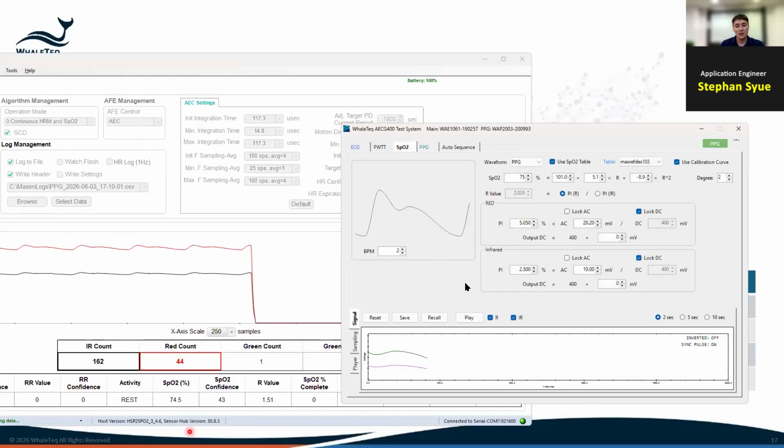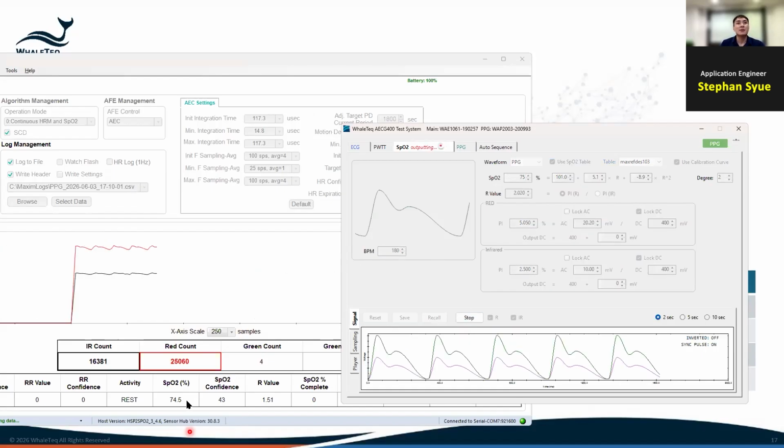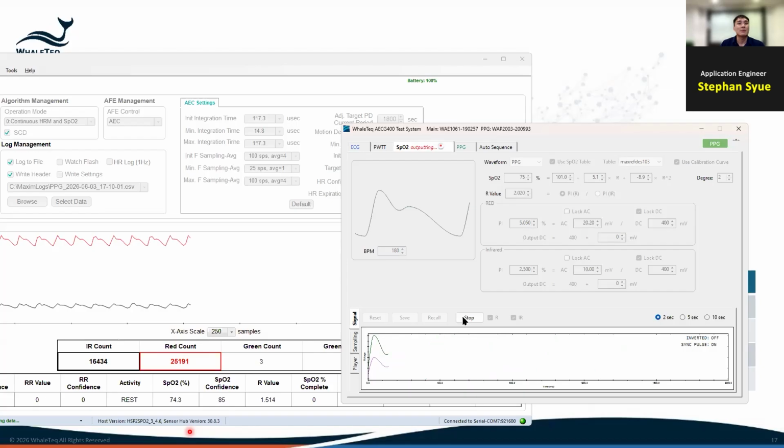Let's speed up a bit to 180. We play. I see immediately the new signal caught, and it becomes much faster, and let's see if it's still okay. Yeah, it's pretty okay. It starts there at 1%, 2%, but it comes back to 1%.